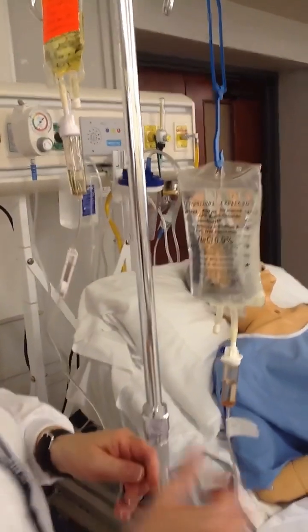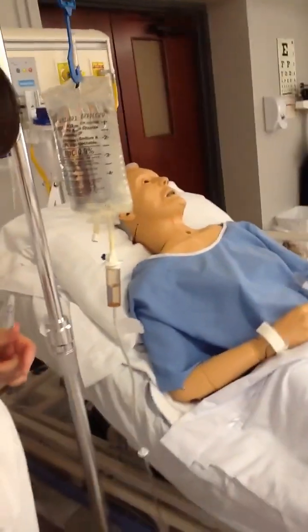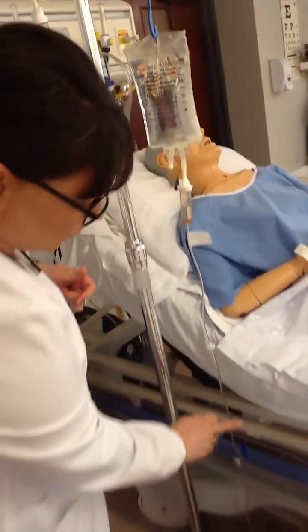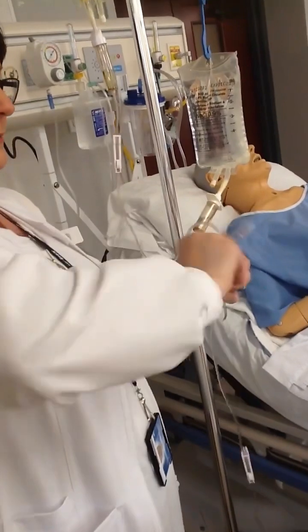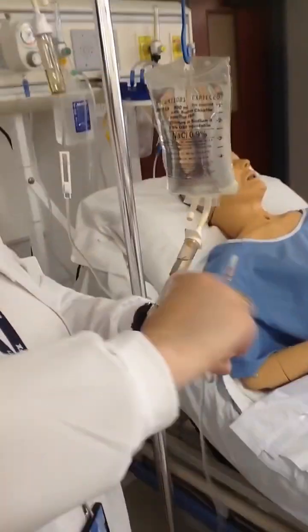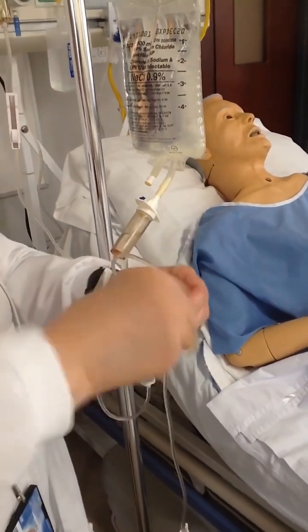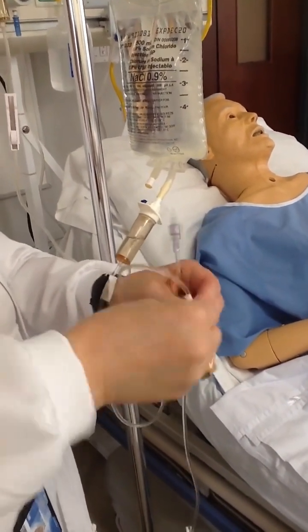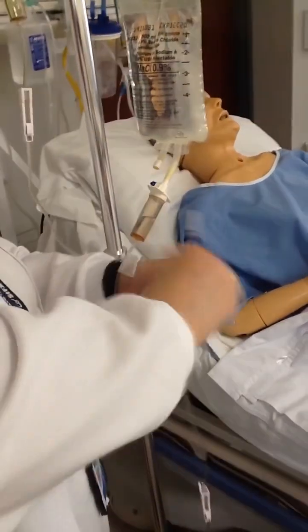I'm going to take my alcohol swab. I'm going to go to that first Y valve, and I'm going to scrub that really well. You hear that scrubbing? That's me killing germs. And anybody who knows June knows that June really enjoys killing germs. So I'm envisioning squishing them under my alcohol swab. So a really good scrub.